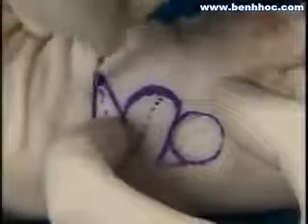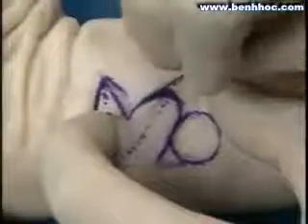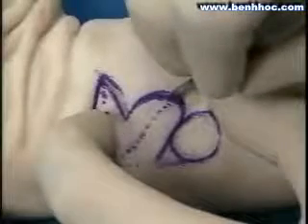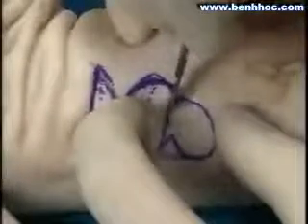Here you can see the lesion has been excised, and now the limbs of the second flap are being incised. The first flap is now being incised, and that's more circular because that needs to be rotated into the area of the defect. Now a triangular portion is being removed as the remainder of the first flap is being undermined.